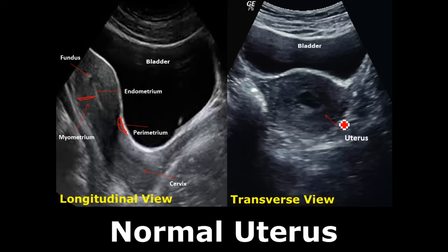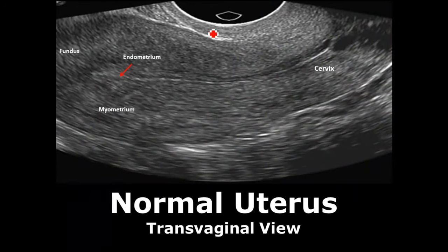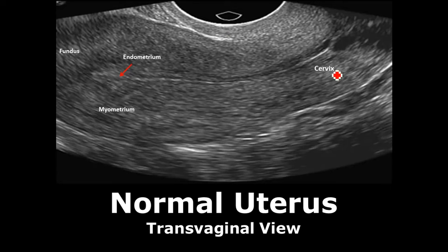In the transverse view, this is the appearance of the uterus below the bladder. In the transvaginal view, we see more detailed information — a zoomed-in view showing the endometrium more clearly, with the fundus on the top portion and the cervix on the bottom portion. The myometrium is also seen very clearly.